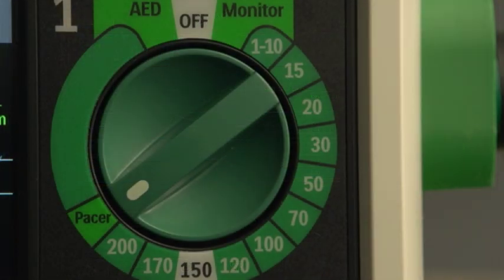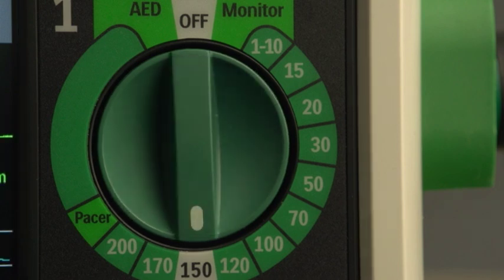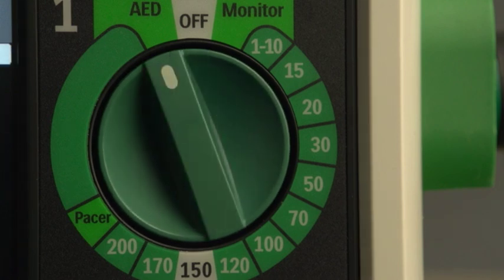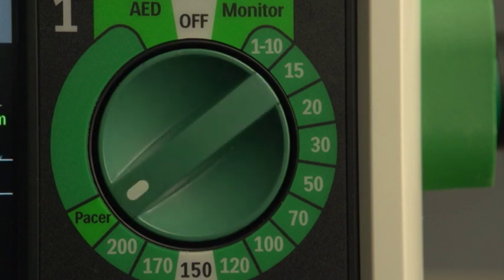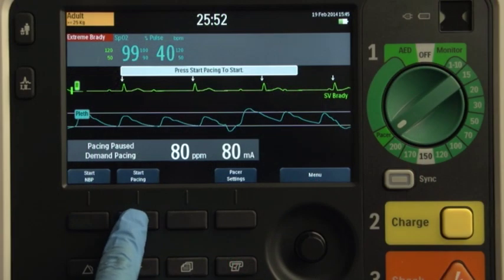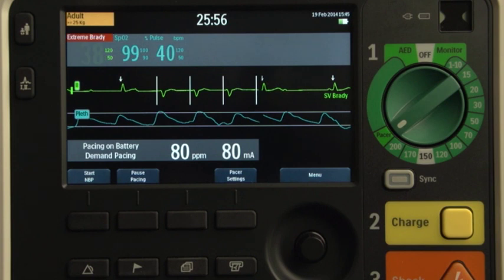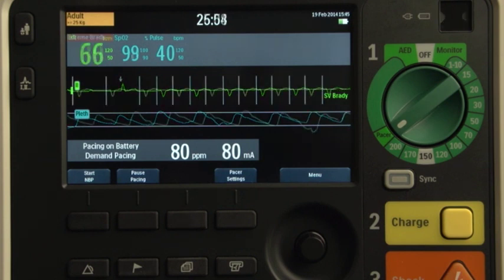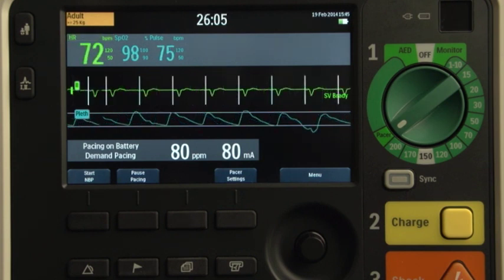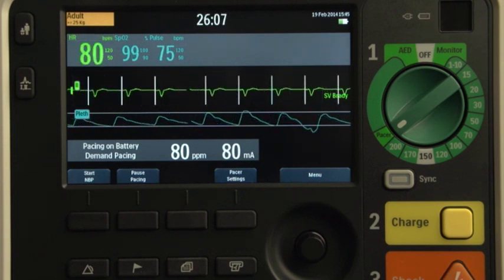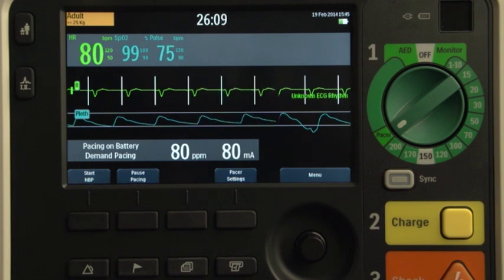Should defibrillation become necessary during pacing, turn the therapy knob to the appropriate energy or AED mode. When you're ready to resume pacing, turn the therapy knob back to pacer. Press start pacing and the device resumes pacing using the previously selected mode, rate, and output settings. Be sure to confirm that mechanical capture has been maintained by checking for a peripheral pulse.